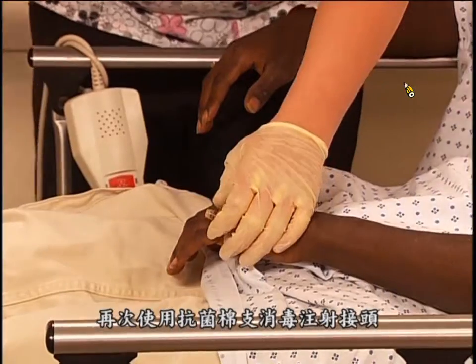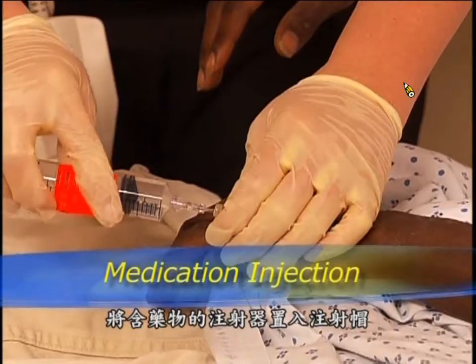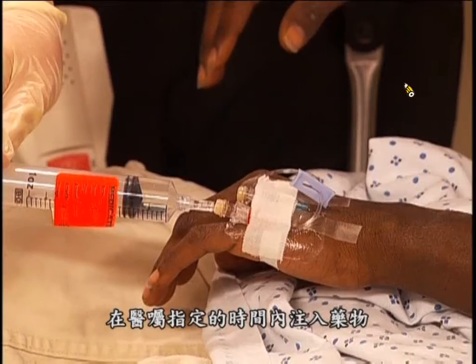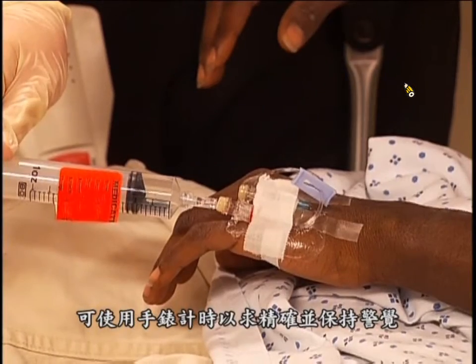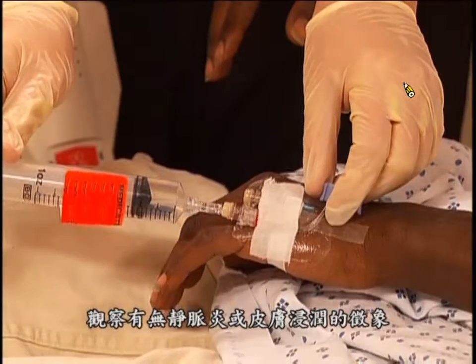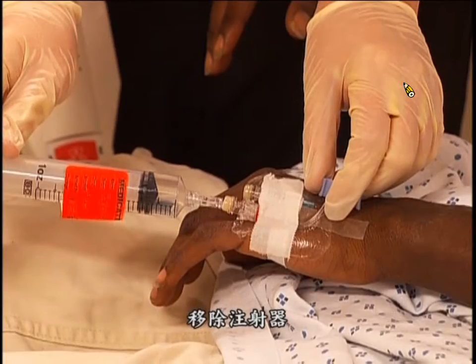Using an antiseptic swab, clean the injection port again. Insert the medication syringe into the injection port. Then inject the medication over the prescribed amount of time, using a watch for accuracy and staying alert for signs of phlebitis or infiltration. When all of the medication has been administered, remove the syringe.